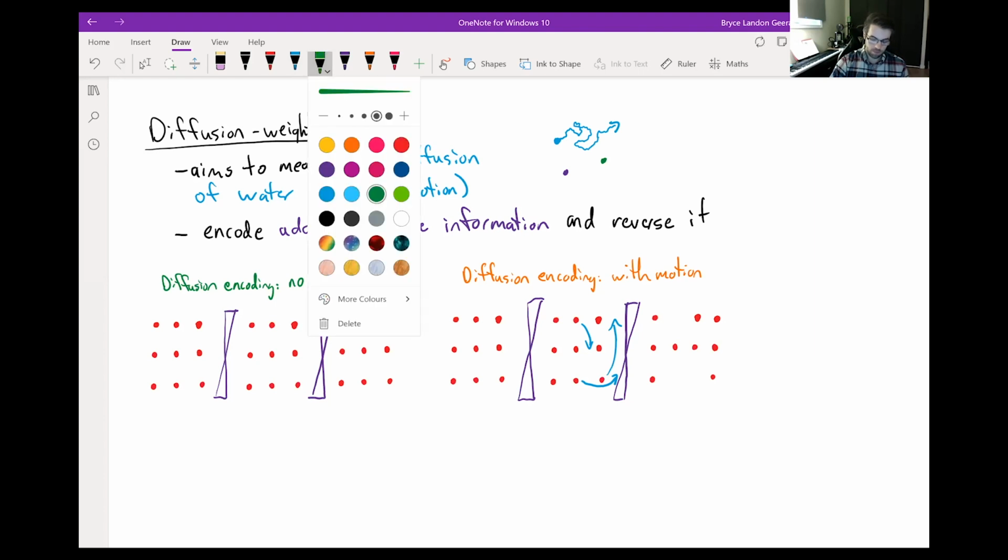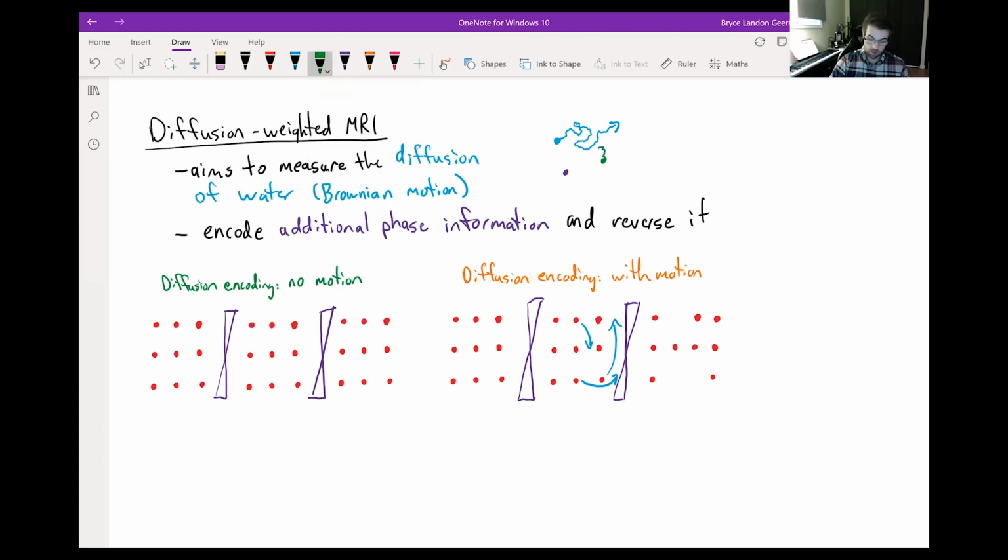It's a silly exercise, but I'll complete it for the 3 of them. So the green one ends up moving in the same direction, southwest, let's say, and the purple one ends up going randomly this way. Who knows? There's no rhyme or reason to how these molecules move, but the point is that each of these molecules is moving on its own.